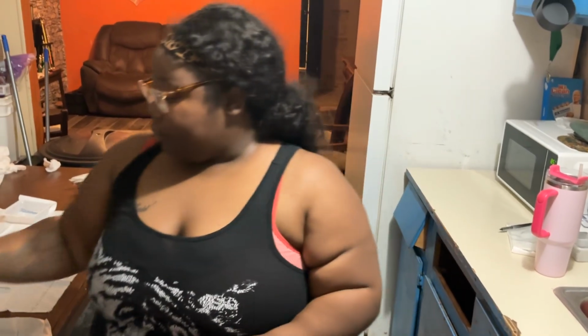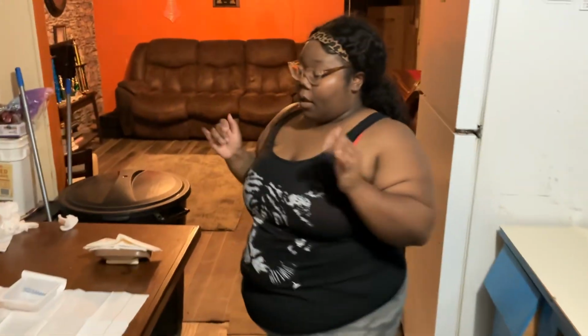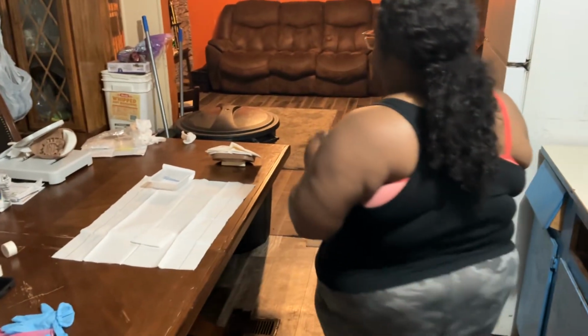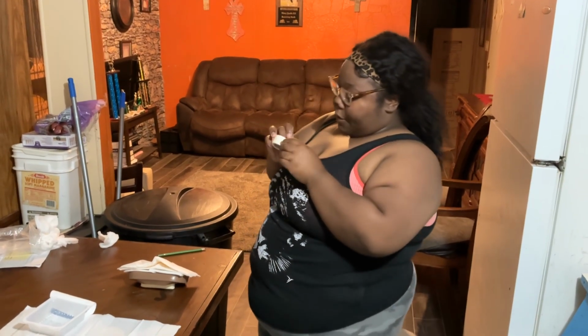I would discard those in the appropriate bin in the real world. I'm going to perform hand hygiene in this moment. Okay, I'm going to get me some tape. I can really discard this in case I need to still be considered sterile or clean. I will perform hand hygiene. Going to get my tape and my writing utensil, because I'm going to label my tape.